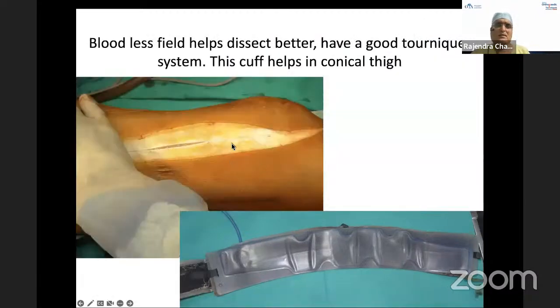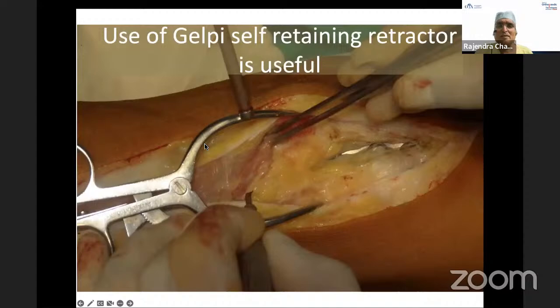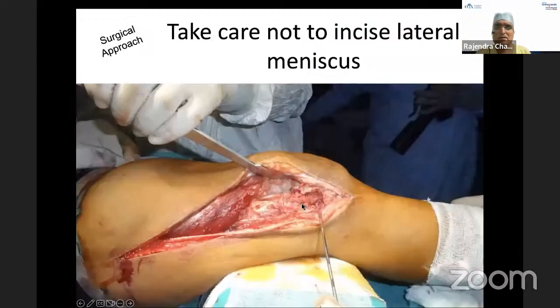So look at the distal femur non-union dissection. It becomes as bloodless as this with a conical tourniquet, and then you can very nicely see all the tissues. So you can completely carry on. This was a distal femur non-union dissection, and then you dissect it out. You can dissect the complete tissues as you want.